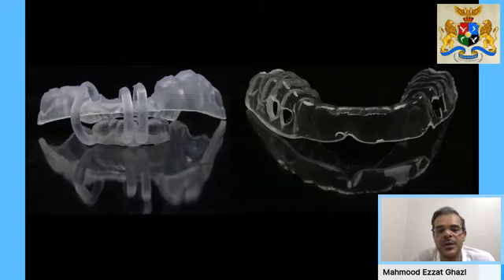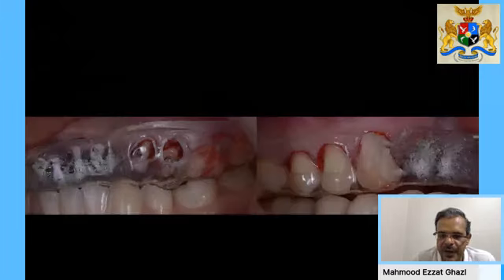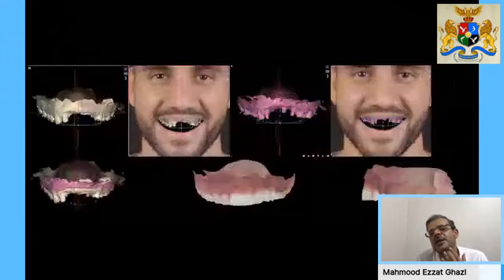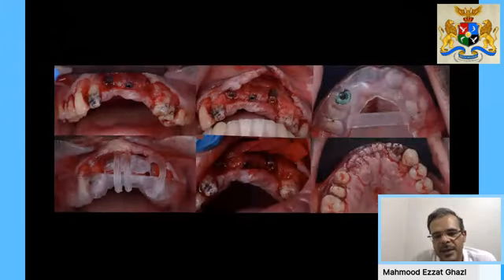This was a guide we used, sorry, for the horizontal bone regeneration, just to show us the level that we need to reach so that we can have a more favorable position. This is the guide we use for the gingivectomies and the crown lengthening. This is the gingivectomy procedure. This is the exposure of the 2 implants that were already placed. We placed another, extra implant in position.